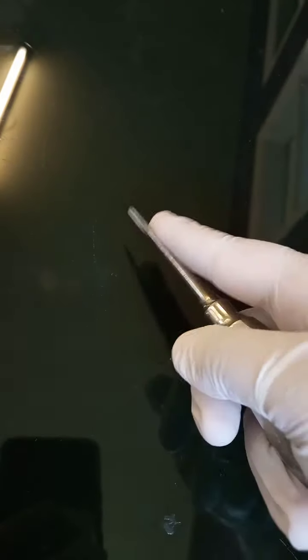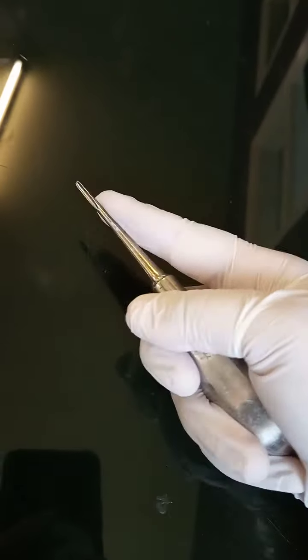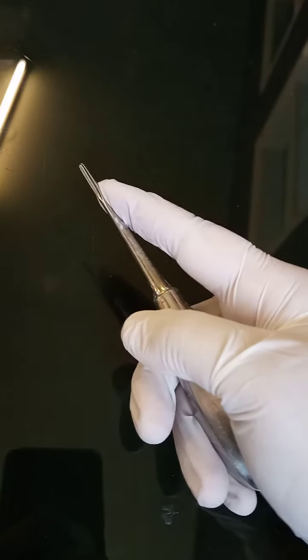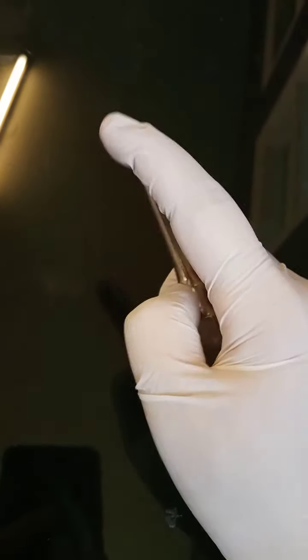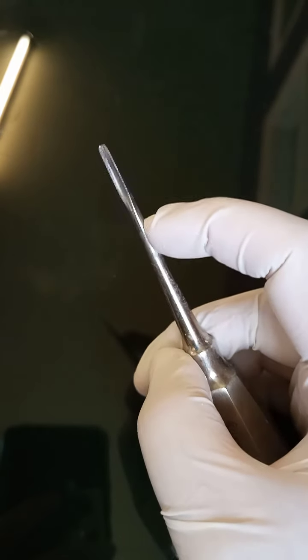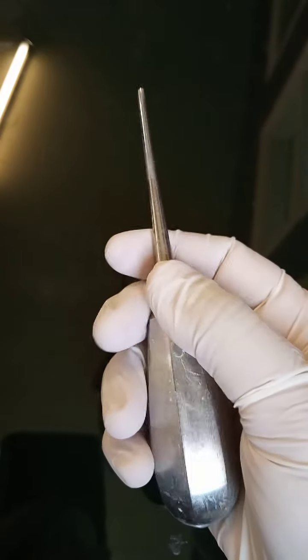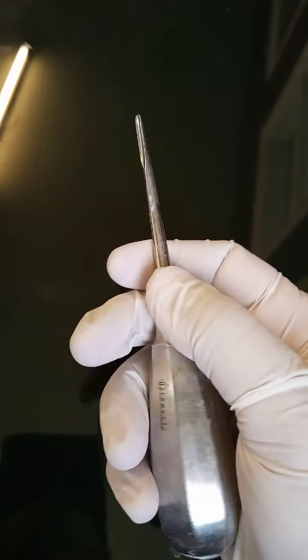This instrument is initially inserted perpendicular to the tooth, either parallel or with the blade angled toward the alveolar crest up to 45 degrees in the coronal plane. It acts as a fulcrum and initiates expansion of the socket, disruption of PDL, causing mobility of the tooth, which ultimately facilitates the extraction of the tooth with forceps.